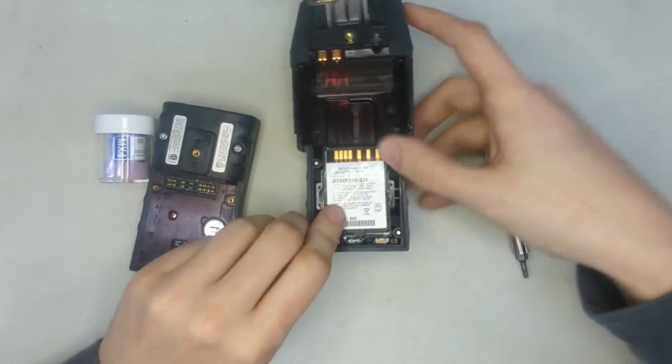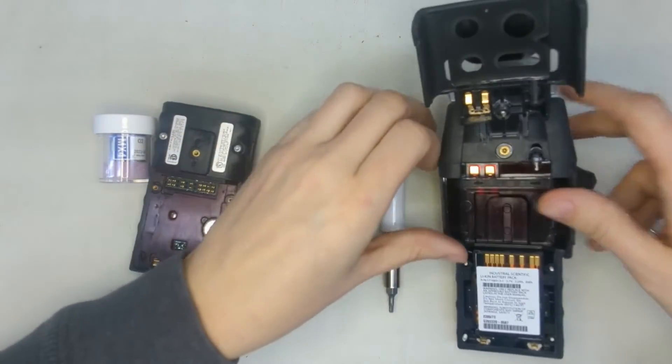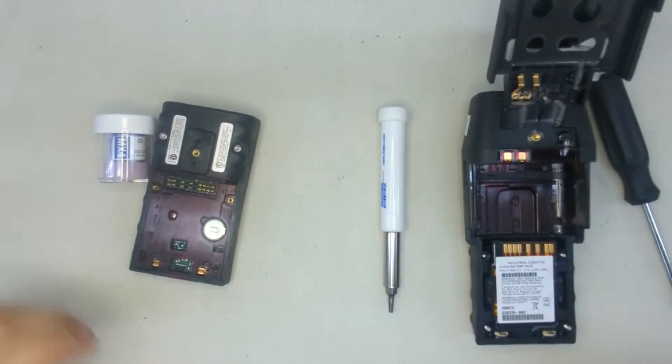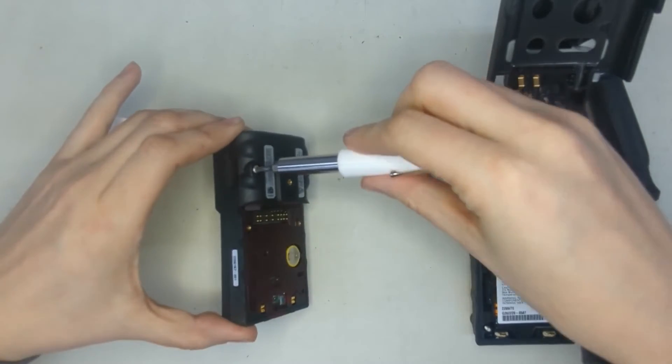Okay, this is your battery here. We're going to put that to the side. Just like that. And here's the unit here. Now we've got two more screws right up here.